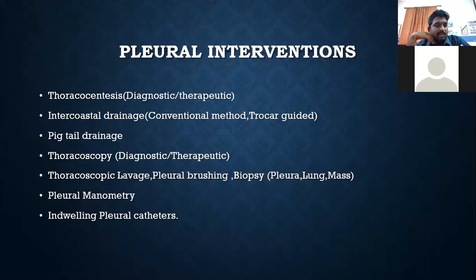He got a good yield when compared to cytology. So what is the basic difference between lavage and cytology? Same thing as what we do in a bronchoalveolar lavage: we put in saline and suck it out with the suction. By doing that, it will shed all the cells, inflammatory cells, all the malignant cells. So it will give additional yield. In addition to the biopsy, when you do a BAL, you get additional yield.